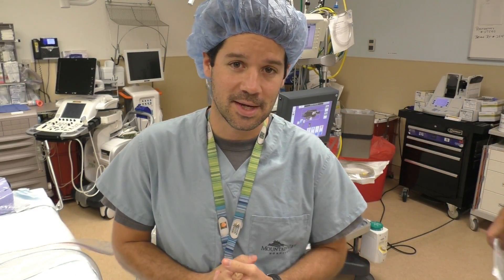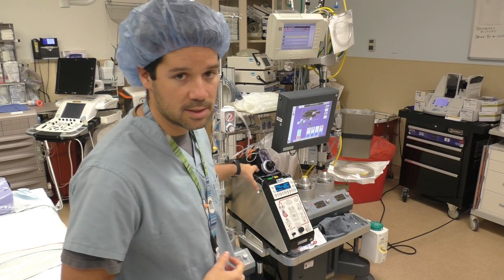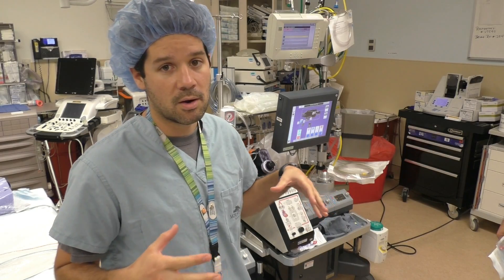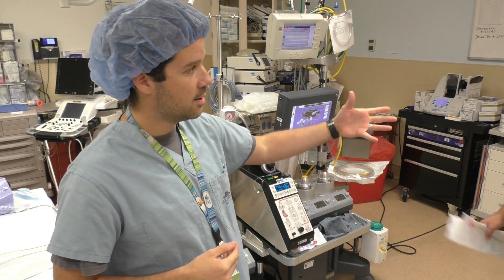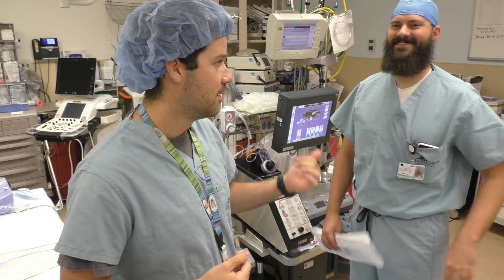Hey guys, welcome back to another Surgical Tech Tips. Today we are going over the perfusion machine itself. This is a machine that you're only going to see in the heart room, only in the open heart room. And I have Sam here, he's our local perfusionist, good guy, crazy good beard as you can see.